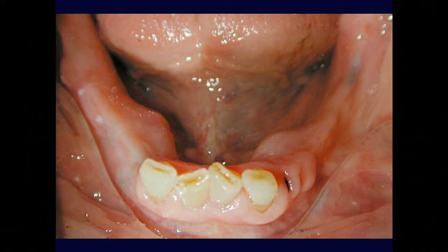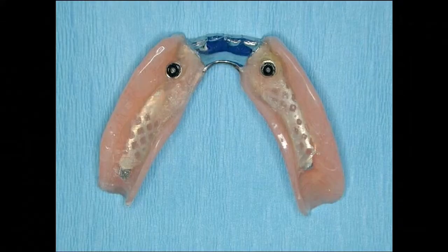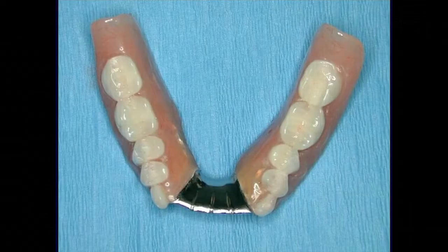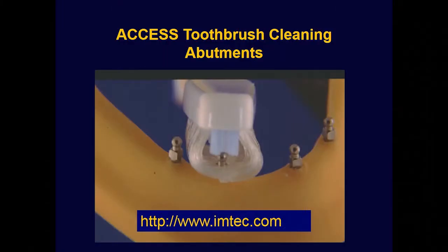This is the one I showed earlier where she wanted to keep these 4 teeth. I said, well, let me put a mini right here and a mini right there. And that's exactly what we did. The case did well for a while, and then she winds up breaking the, I showed you this earlier. She winds up breaking one of them, and then we put another one, and then she broke that one. So we put a real implant in. But this has held up well.